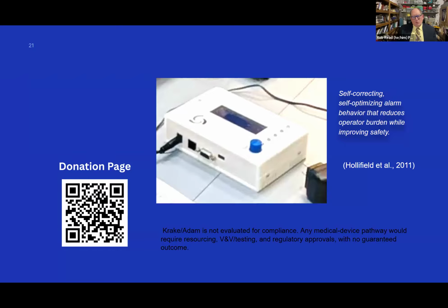So one thing we can think of that we haven't touched upon is making the alarm management system really intelligent. Nowadays people would say artificially intelligent. I kind of don't like that idea, but let's imagine that we had an artificially intelligent thing. I like to think of it like a little super brain in a box in the alarm management system. Well, it could do something quite radical, like it could detect that the operator is not an expert. And on the basis of detecting that, it could change the messages that it gives.